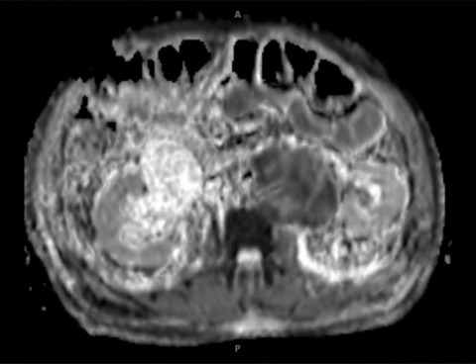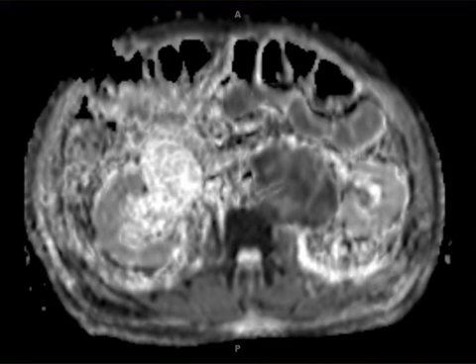Incidental note is made of moderate hydronephrosis on the right, an unrelated finding. The differential for this mass includes retroperitoneal sarcoma as well as lymphoma, given the prominent diffusion characteristics.